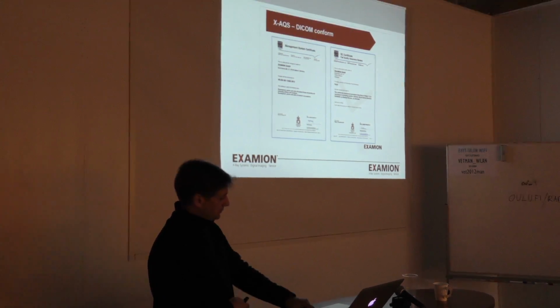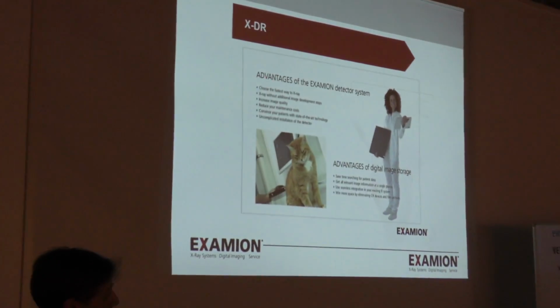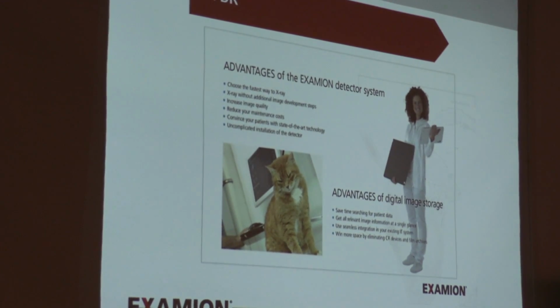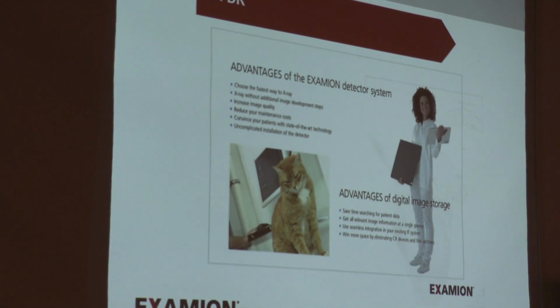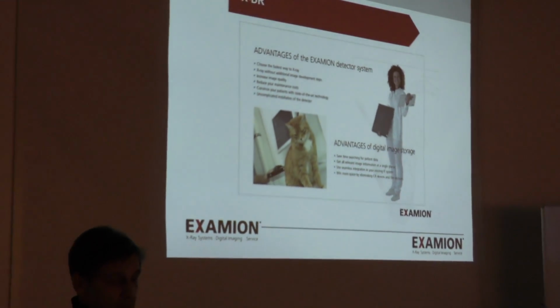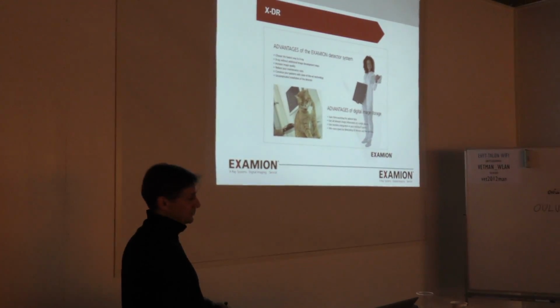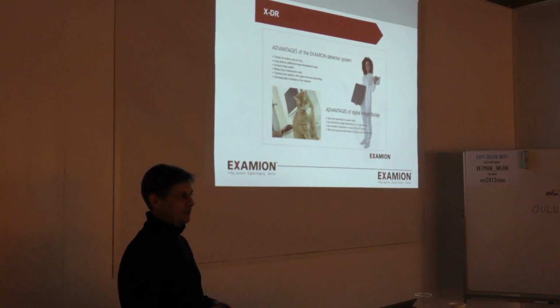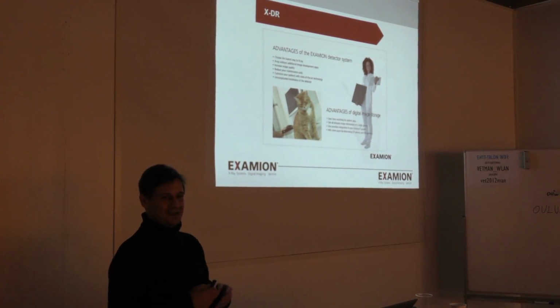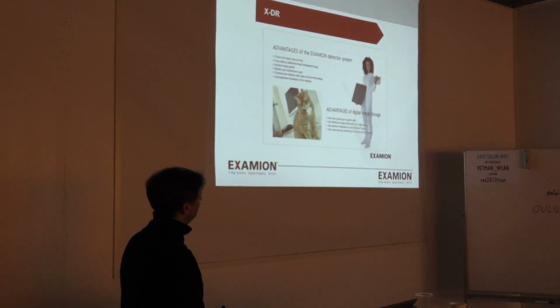Some DICOM statements, so we went through that. Detector systems: today, although there are still people in the world working with chemistry and film, in most countries by law these have been forbidden. In some countries it's still allowed, so it's very variable, but you don't see it that much anymore. Those who still have it, instead of changing, it's maybe because the clinic is almost going into pension. They said maybe it's not worth the investment to do anything else, so they rather stop the X-ray business than move on.